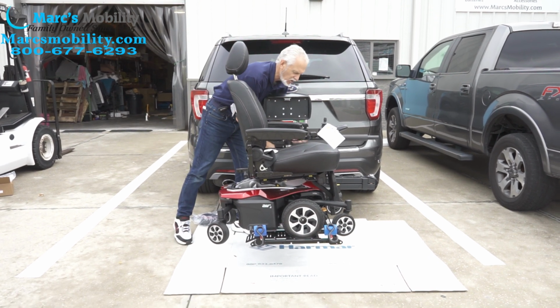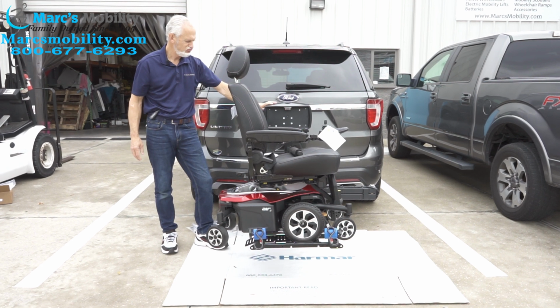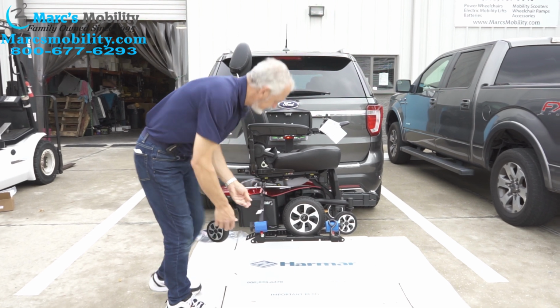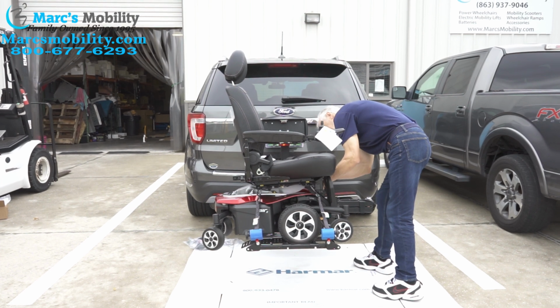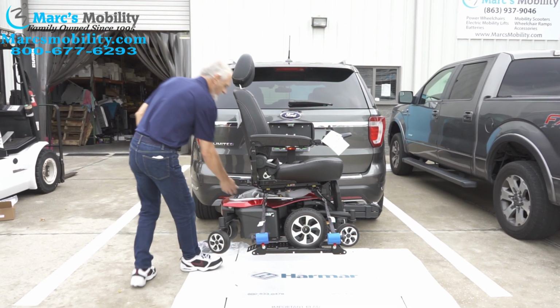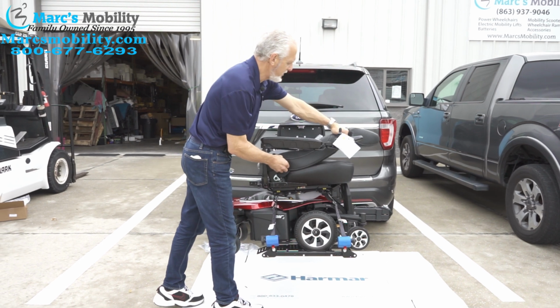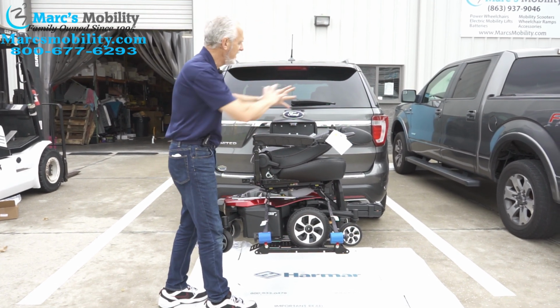Then of course you have to put your arm over the seat. And then put your straps. All 4 straps. So as you can see, you can put a smaller chair on here, and when you go down the road, make sure your back is folded down and your power is off always on your joysticks, and then put your cover on.